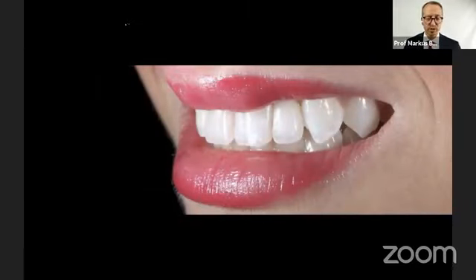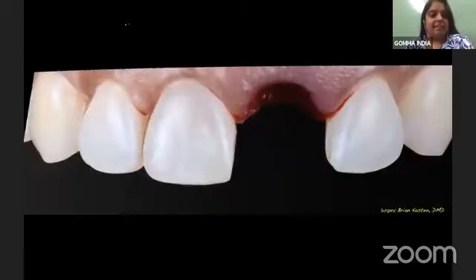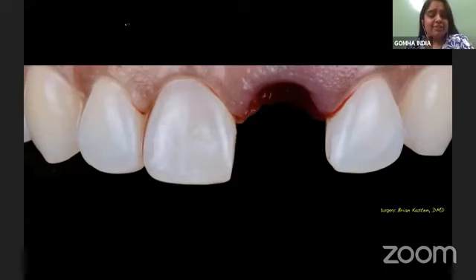And this is pretty much the message I have for you on how to bond to zirconia. Okay, so first you follow air abrasion, and then you follow the primer, and then you move on to composite. Don't you use a bonding agent in between?